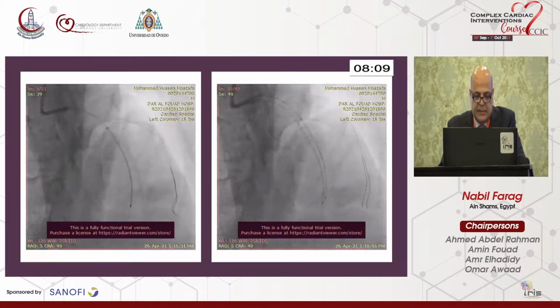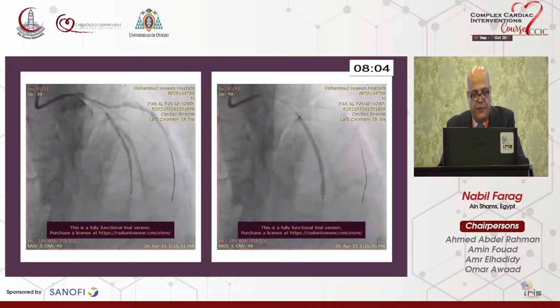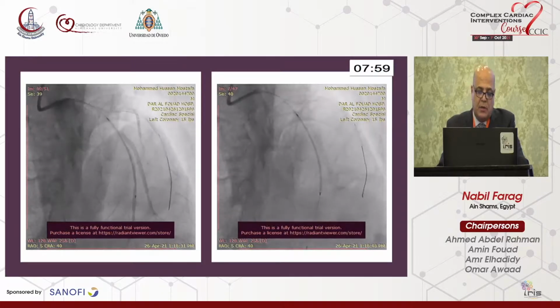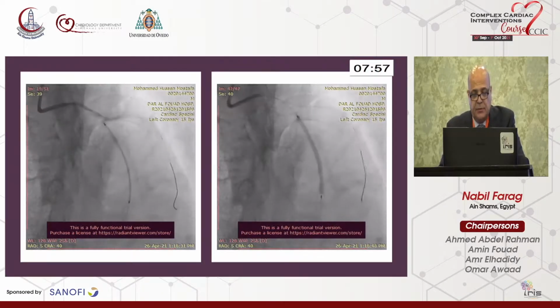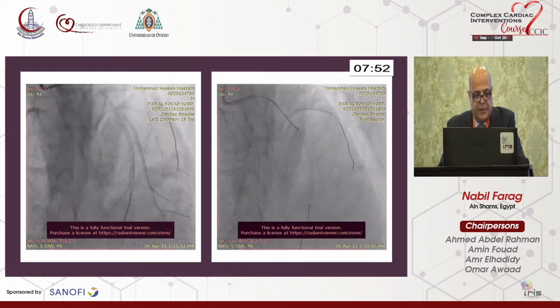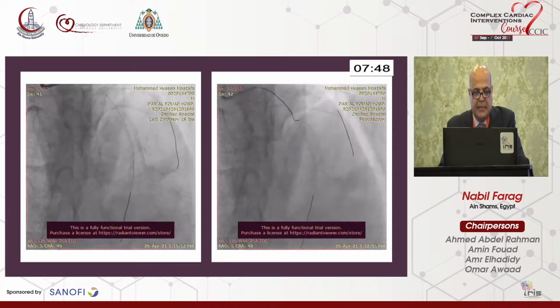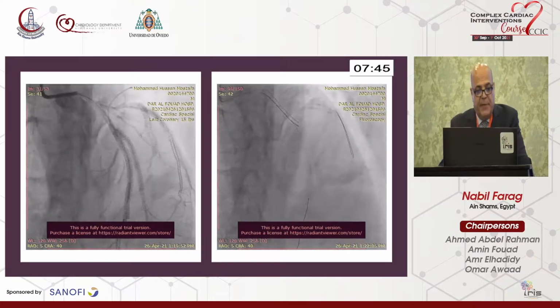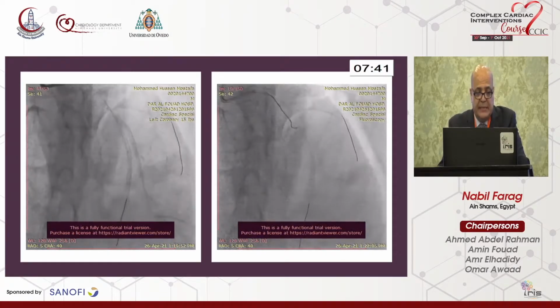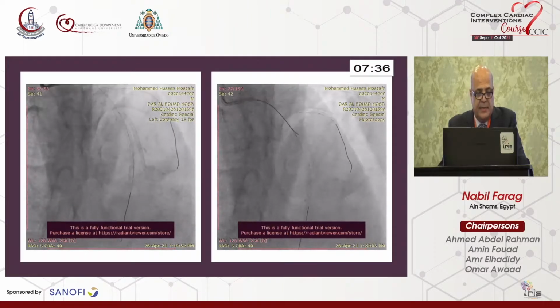It was a long stent because it was also a long lesion. And after stenting of this LAD, crushing the diagonal stent, we have to cross again to the diagonal artery. This is after stenting of the LAD, we recrossed, and this recross is through 3 layers of metal, the 2 layers of the crushed stent and the layer of the LAD stent. Then we crossed, and we did the second kiss.